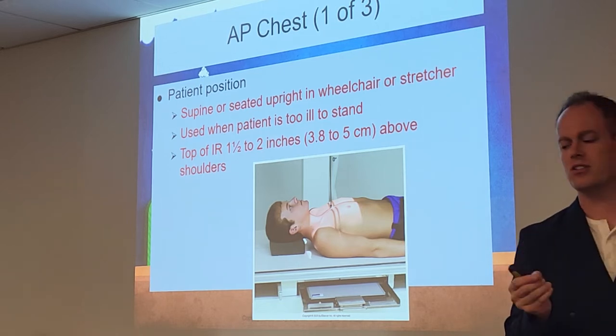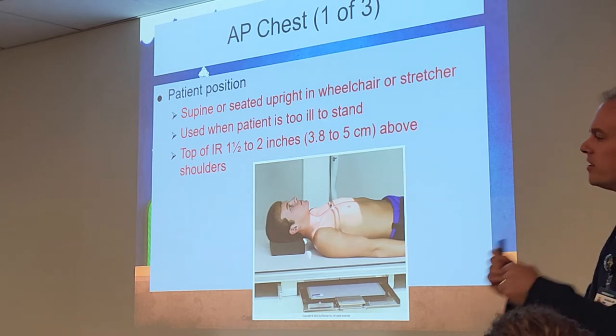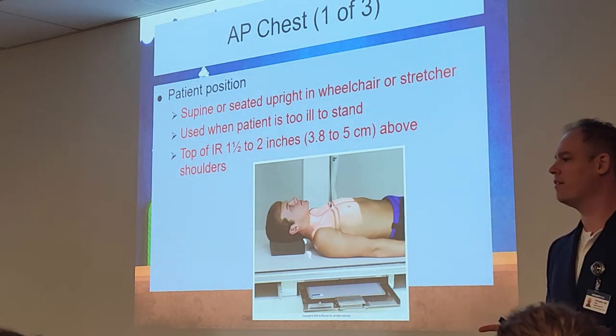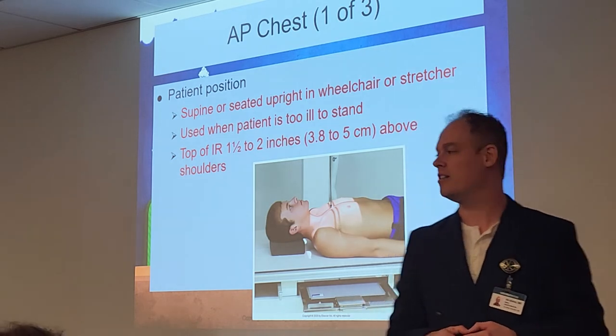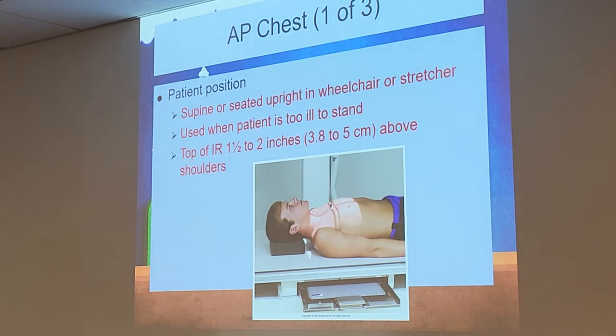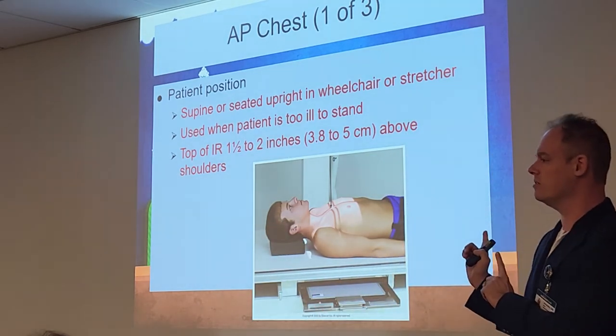But I want you to put a big star on this because I've said this before. You're going to work with techs that do portable x-rays, and they're going to put that tube really close at 40 inches. That is not acceptable or optimal for a chest radiograph. You should always strive your best to achieve 72 to optimize that AP chest, no matter what John, Bobby, Sue, Kelly, whoever says. They're telling you that's the best way to do a mobile x-ray. No, it's not. It's still 72 inches no matter what. You should be trying to achieve that. They say, oh, just push it closer, it's easier, it looks better. No, it does not. It always is optimized at 72 no matter what on chest x-ray.